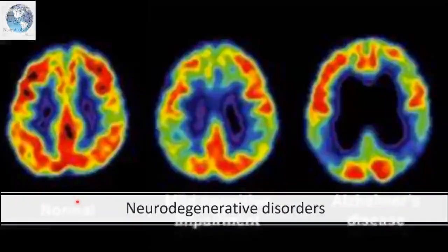Okay, so for PET, we've mentioned it's very useful for neurodegenerative disorders. Walaupun FDG ni like all over the brain, you can see, but it has its role because it's more commonly available. And more commonly, the low areas are the problematic areas lah for the neurodegeneration. Sebab area yang kurang glucose, maksudnya mungkin sel dia dah rosak. The cellular function is impaired. That's why you have low glucose perfusing there and therefore leading to the cognitive deficit in that region. So the brain imaging for the neurodegenerative is more about detecting hypometabolism.